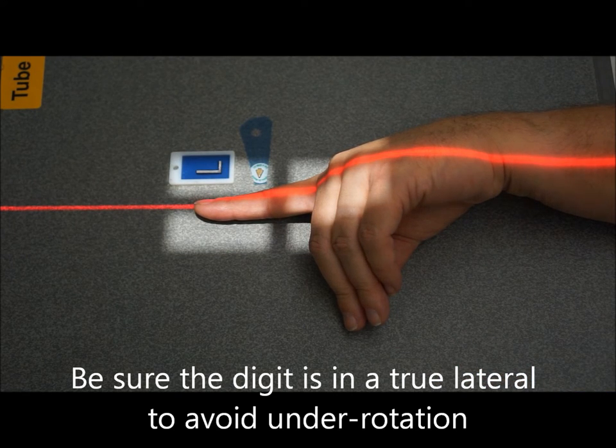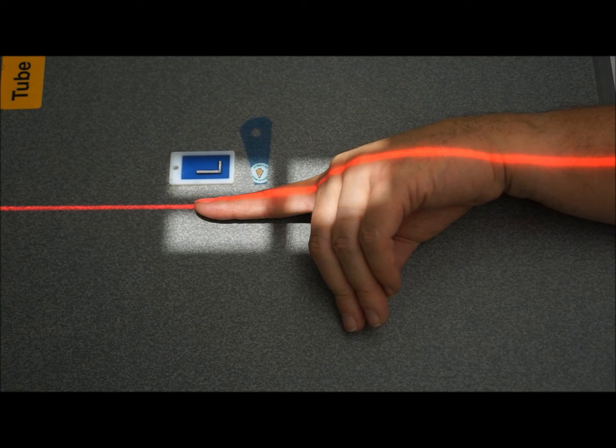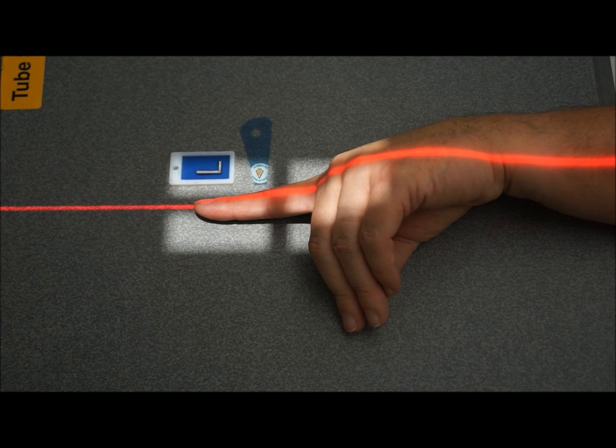Again making sure we get distally all the way down to the metacarpophalangeal joint. And that is the lateral second digit and this was a three view second digit demonstration.